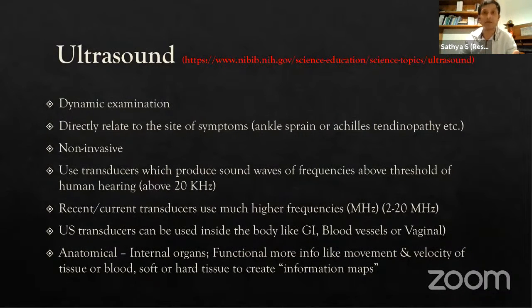We use real-time ultrasound as biofeedback for people to use as a tool. And ultrasound transducers can be used inside the body to understand blood vessels, or for women-related issues. Anatomically, you can look at some internal organs.